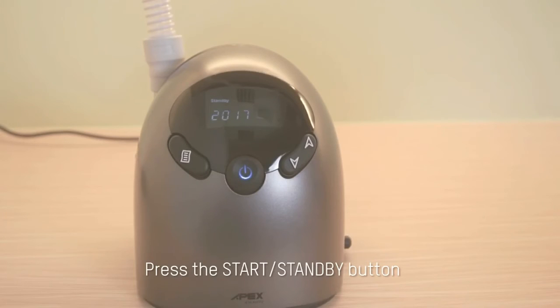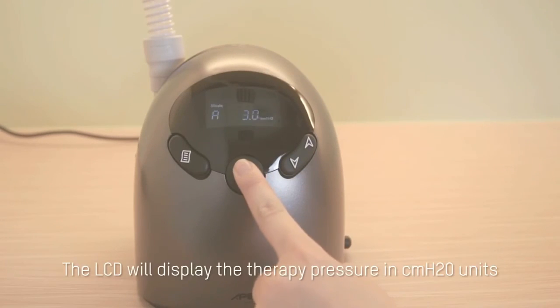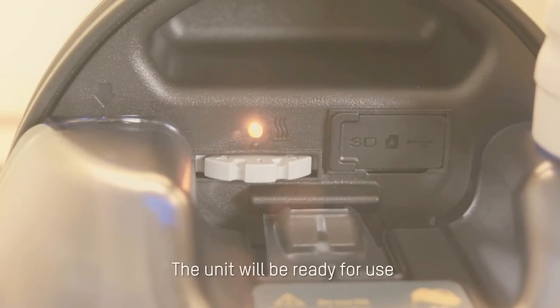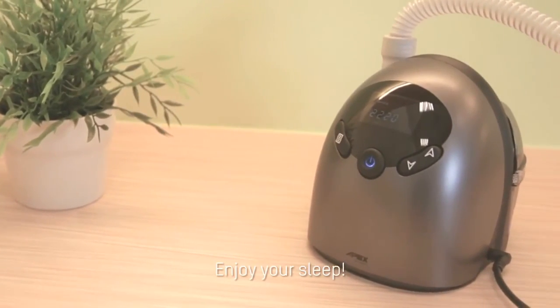Press the Start Stand By button. The LCD will display the therapy pressure in CMH2O units. The unit will be ready for use. The ICH is now set up. Enjoy your sleep!